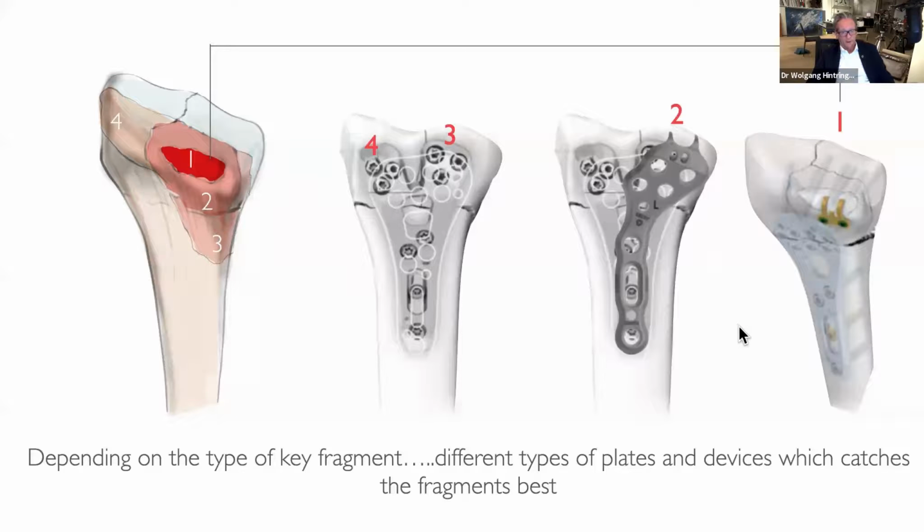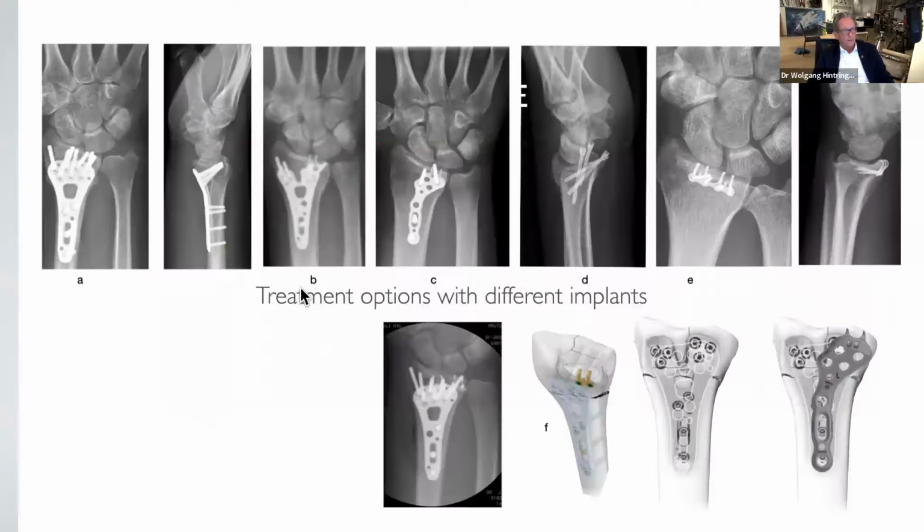You have to tell your nurse what you want to operate on the next day, and that she should prepare the set, maybe with that special plate, or you have to ask her if the hook is on the set, and so on. You have to check your fracture previously that you have the right material. And in the future, it's also very important because you get single-use sets and there maybe is only one plate, and that must be the right plate.